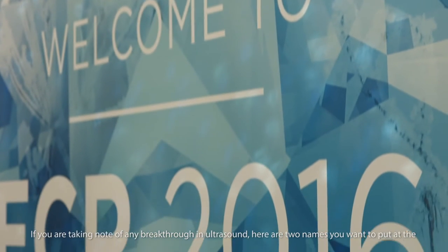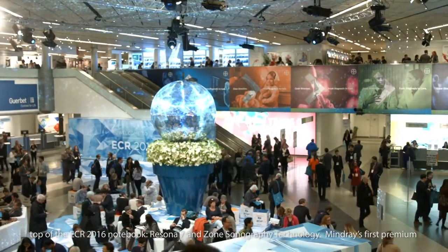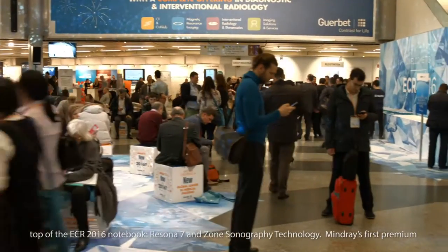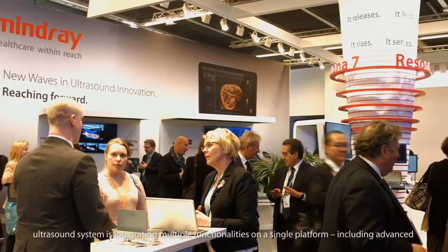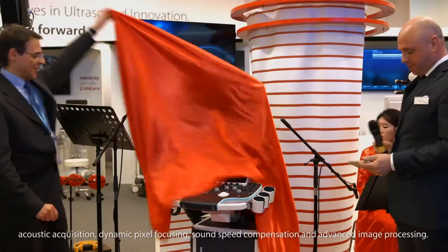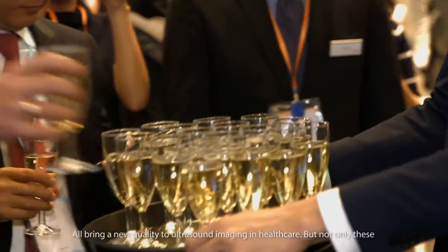If you are taking note of any breakthrough in ultrasound, here are two names to put at the top of the ECR 2016 notebook: Resona 7 and Zone Sonography technology. Mindray's first premium ultrasound system integrates multiple functionalities on a single platform, including advanced acoustic acquisition, dynamic pixel focusing, sound speed compensation, and advanced image processing — all bringing a new quality to ultrasound imaging in healthcare.